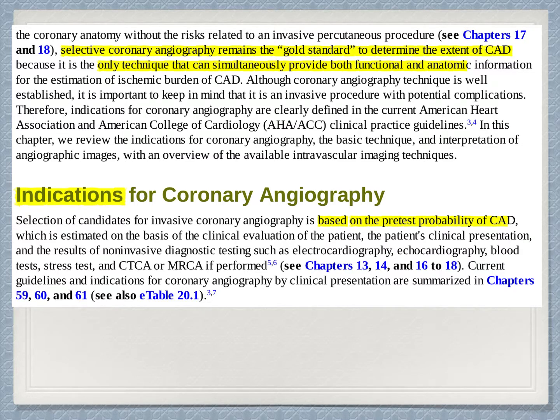Selective coronary angiography remains the gold standard to determine the extent of CAD. It is the only technique that can simultaneously provide both functional and anatomic information. The indications are based on the pretest probability of coronary artery disease in general.